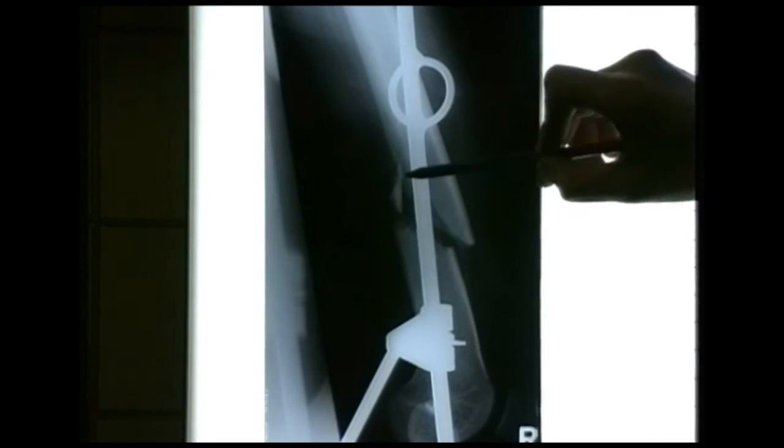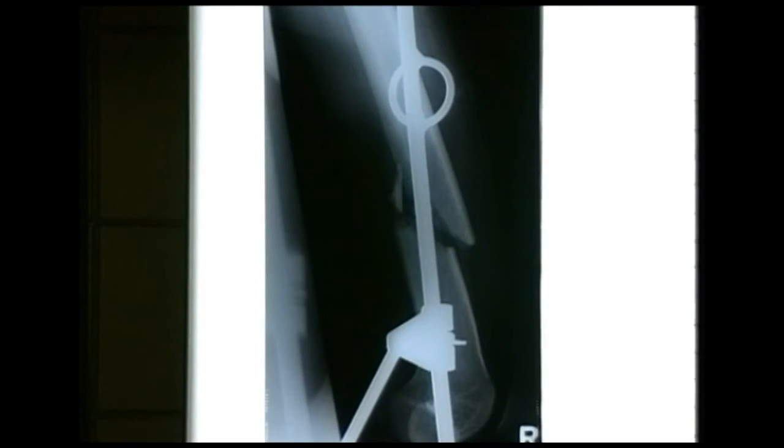There's a comminuted fragment — a small butterfly fragment — visible here. That can be left and will almost certainly heal into the rest of the bone.